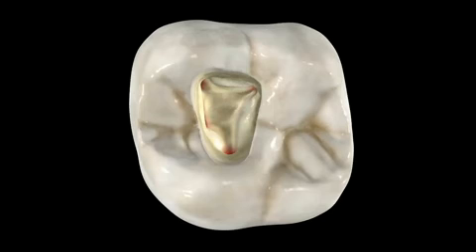It's not a personal philosophy. The size of the access cavity is dictated by the orifices on the pulpal floor. The walls then should diverge from the pulpal floor out to the occlusal table. It's important to finish the accesses, and a good indicator for finished accesses is the axial walls are flared, flattened, and finished. Well, now that you're into the tooth safely, we're now to our assignment of canal preparation.